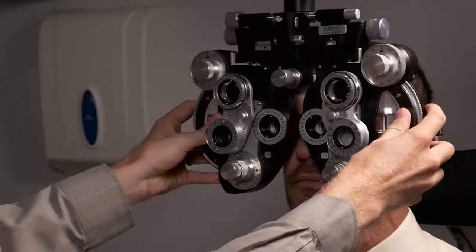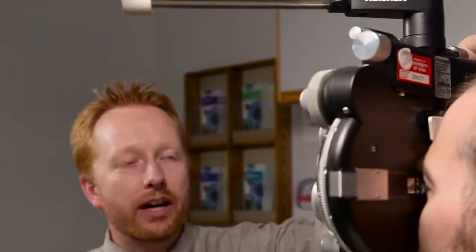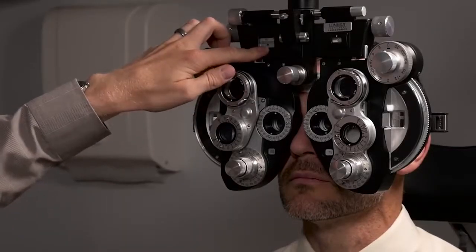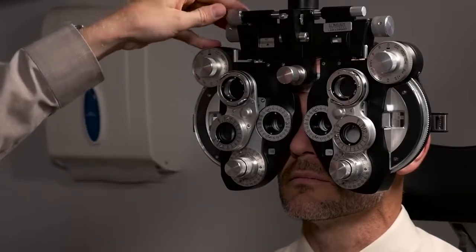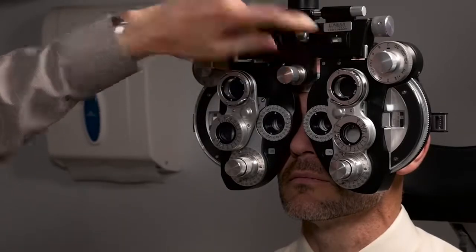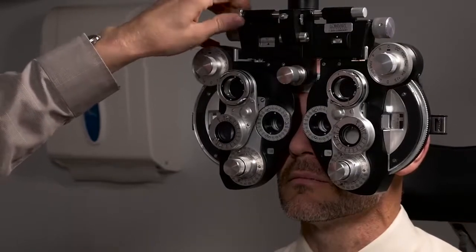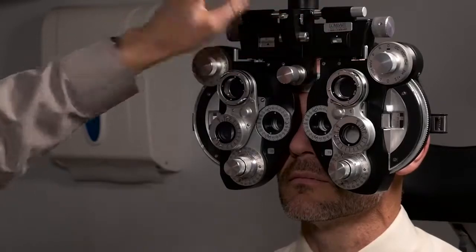We're going to start by putting the phoropter in front of the patient. It's important to make sure that the pupil distance in the phoropter matches the pupil distance of the patient. There's a knob at the top that adjusts whether the pupil distance is smaller or larger. In this case, this patient has a pupil distance of 62, so I'm going to set it at that indicator line. Another important thing is to make sure the phoropter is level, using this leveling window, and you adjust it by turning the dial above to get the bubble and the dot to match up.